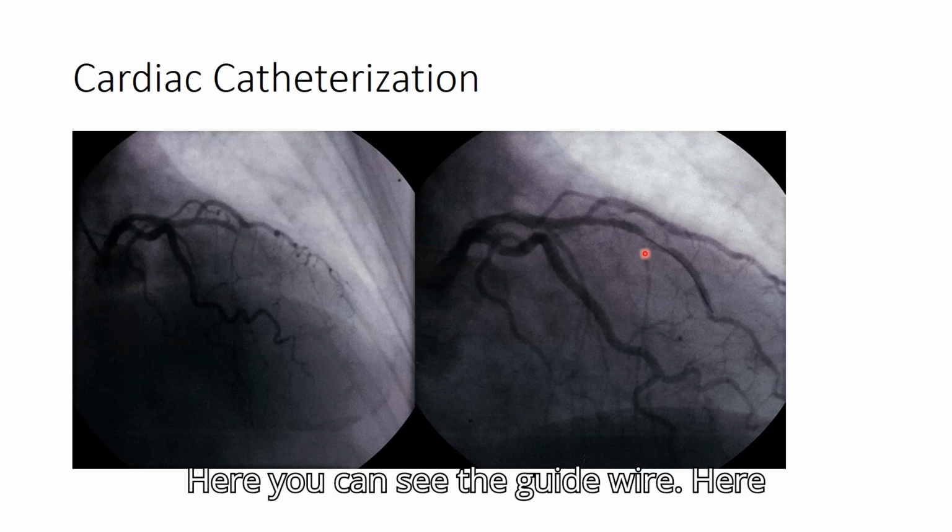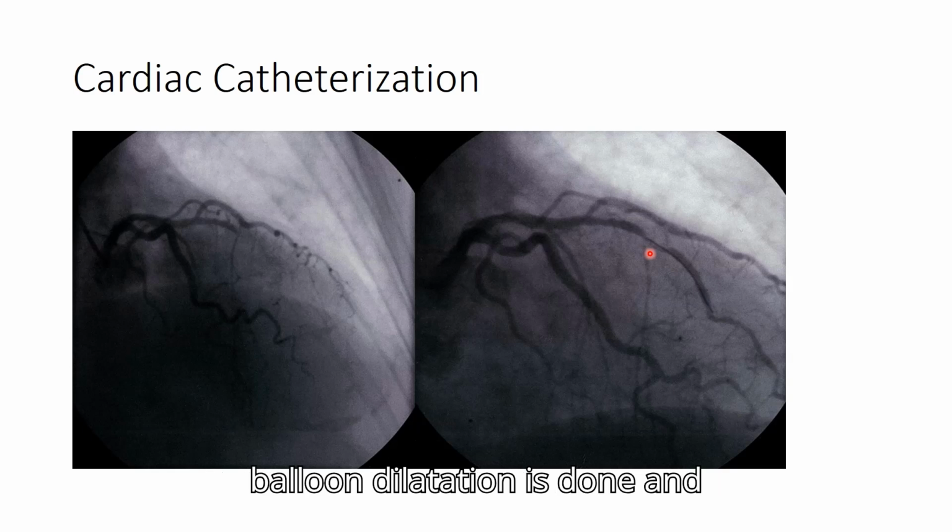Here you can see the guide wire. Here balloon dilatation is done and reperfusion is achieved. Further to this stenotic patch, partial stenosis has been relieved by balloon dilatation and reperfusion has been achieved. Remaining stenosis will be relieved by stenting.